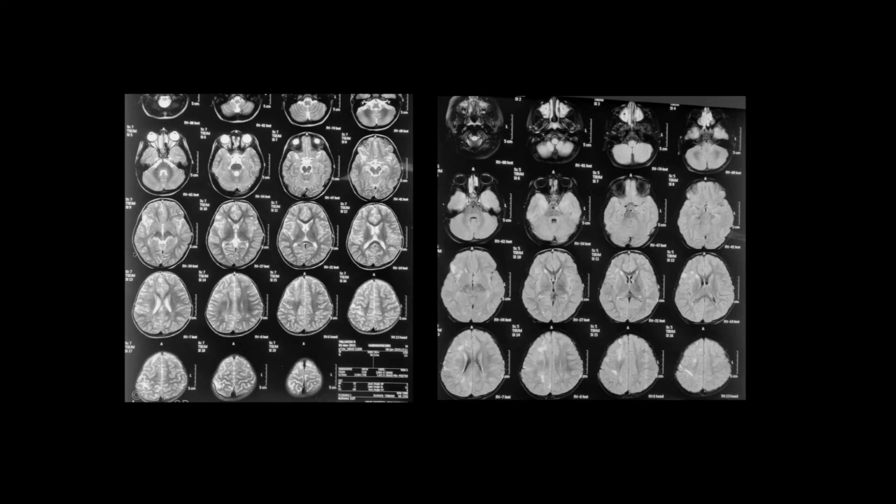Sorry to join late. I just rejoined as panelist. I was not able to speak earlier. So this child has clinical seizures which correspond with that right parietal lesion, just around the central sulcus, right? Centroparietal. So the EEG changes and clinical seizures are corroborating with that particular lesion. But overall, I was not sure what this pattern of injury is suggesting. Is it a hypoxic injury, a global hypoperfusion injury? That was the main question. Clinically, there is no acute sentinel event now, but he had some neonatal complications requiring NICU admission.